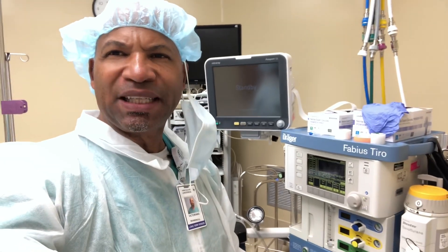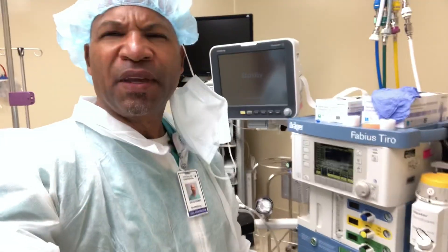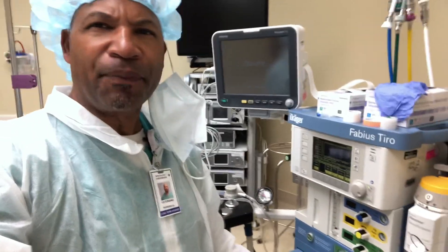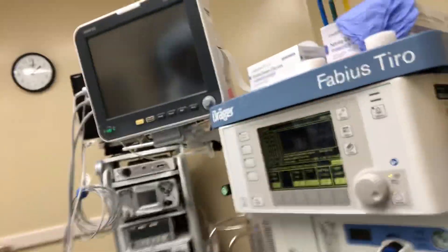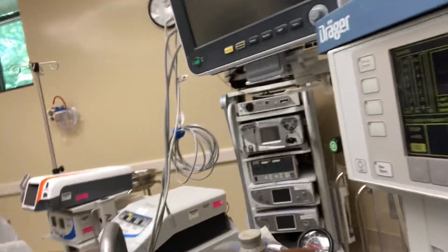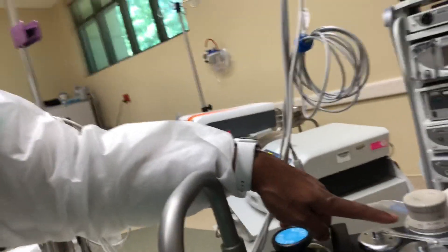Now we're doing the leak test on the Fabius Tiro — it's a pretty straightforward procedure, but follow the on-screen prompts. Right now it's in process; we are looking at the centimeters of water gauge and we have our settings.